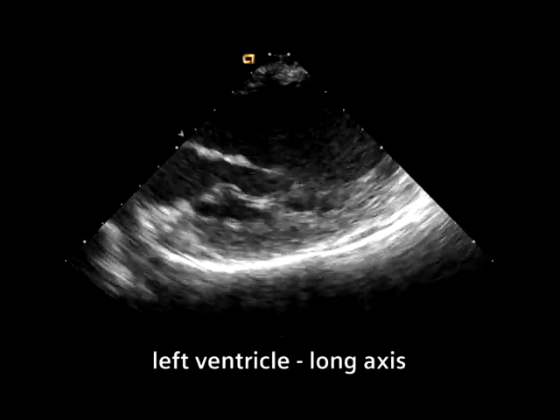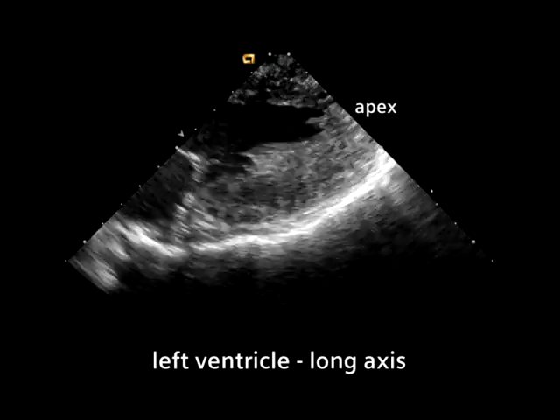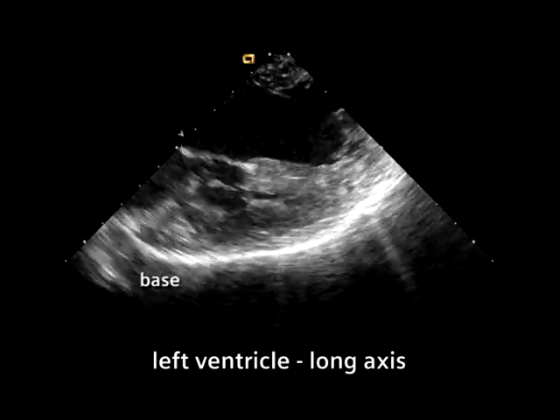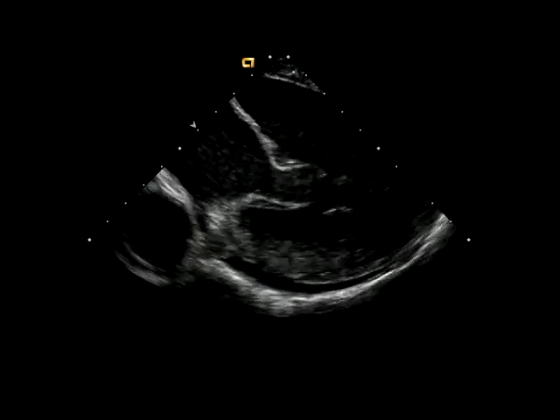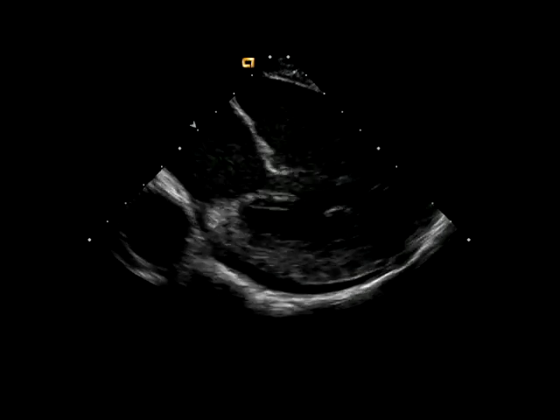And typically from this catheter location, there will be a long axis view of the left ventricle, and either by advancing the catheter farther to bring the catheter more towards the apex of the left ventricle, or farther back if the imaging target is the base of the left ventricle, the catheter in its contact with the left ventricle can be monitored during ventricular tachycardia ablation.